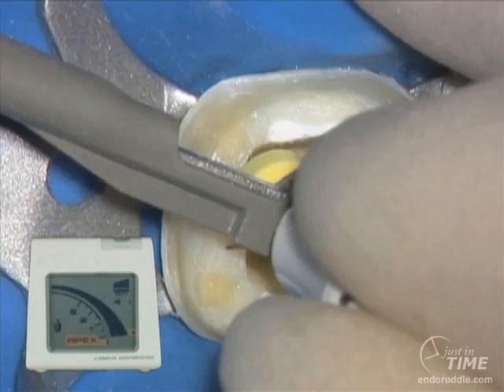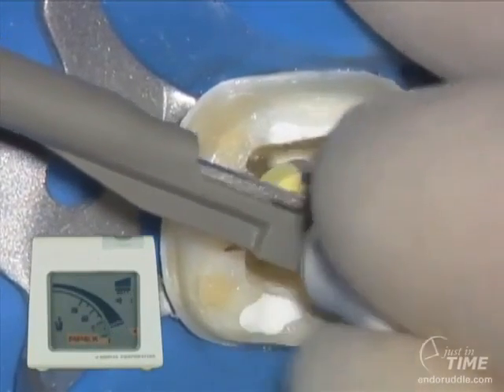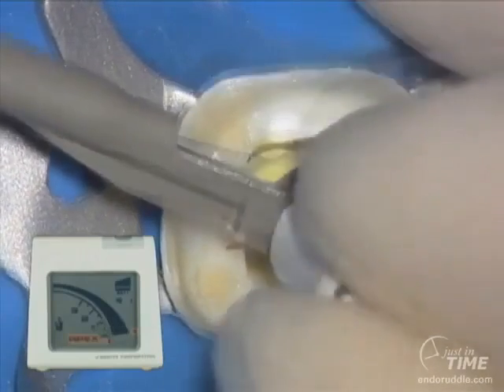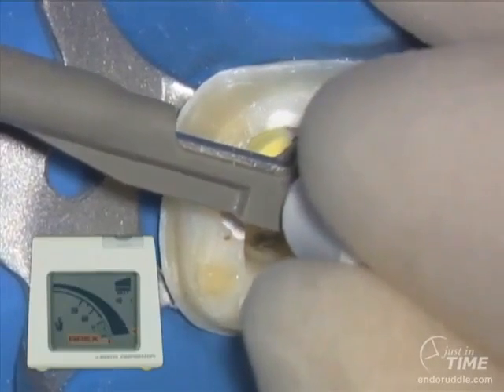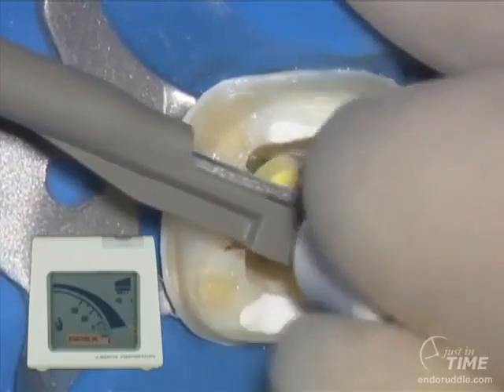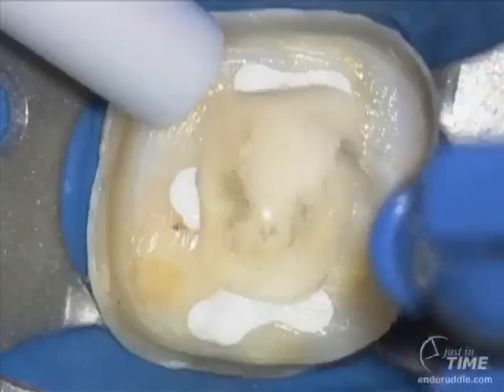It's important to move the file back about a stop, and again the stop is about 1 millimeter. If we were to move the stop back about 1 millimeter, you would expect the digital readout on your apex locator to move back about 1 millimeter. Basically what I'm saying is, when the fingers move the file back about a stop, your digital readout should move back about 1 millimeter. Pretty much the readout should simulate exactly what your fingers are doing. And if that is the case, you can have a lot of confidence in your electronic apex locator.